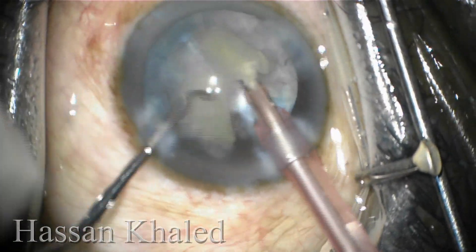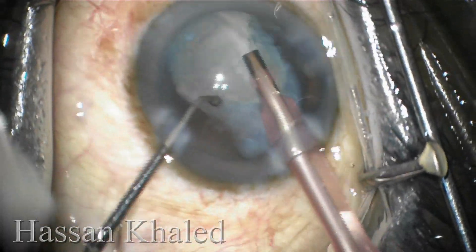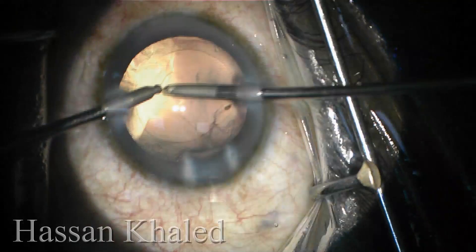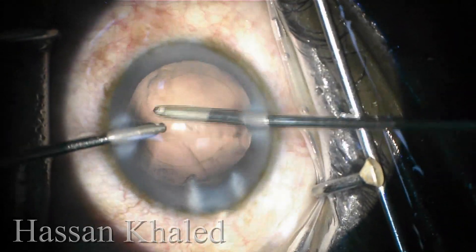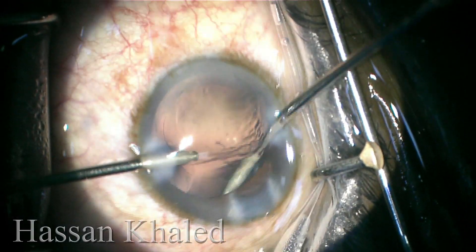Here you can see the cortex aspiration with the phaco probe. Now removing and cleaning the cortical matter using the bimanual irrigation aspiration.